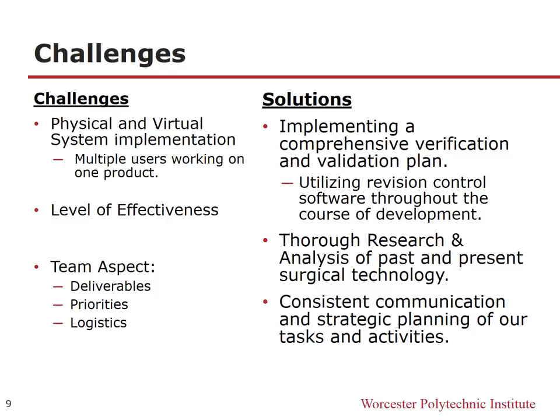To remedy these challenges, we'll be executing a comprehensive verification and validation plan. This will help ensure the software developed meets the specifications and user needs. We'll utilize revision control software to protect each iteration of development while multiple users engineer.